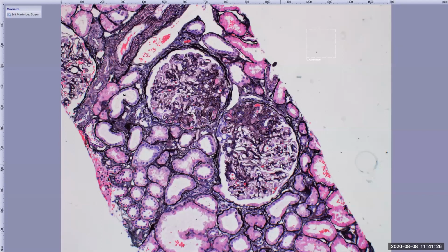Morphological classification, initially we thought, like many times when we go over the morphological classification, we get confused. Is it a primary or secondary? So morphological classification is not going to help us distinguish that. So the NOS variant, which I showed you initially, and the perihilar variant, which I showed you just now, are just morphological variants.